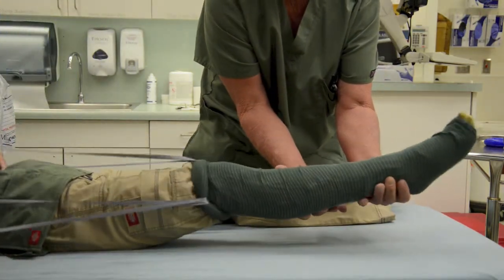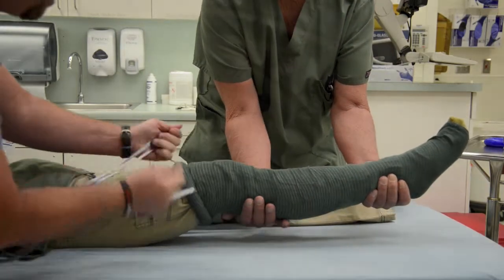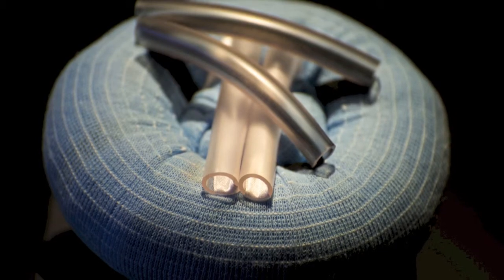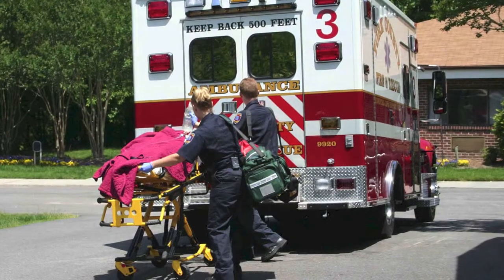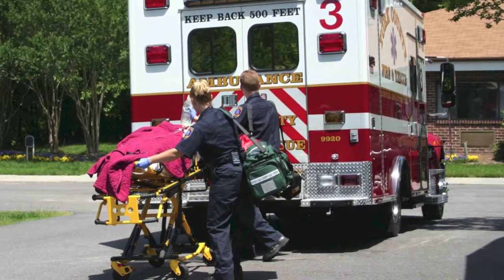This removes the demand on the blood supply from the legs and increases systemic vascular resistance. Used in conjunction with traditional methods of resuscitation, it serves as a bridge to definitive treatment for any shock state. Prompt transport to a hospital or to definitive care is paramount for complete stabilization and removal of the device.